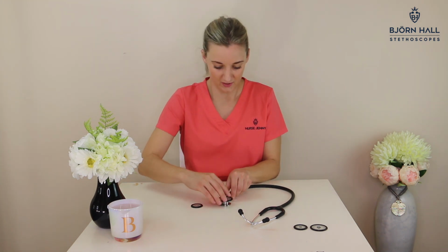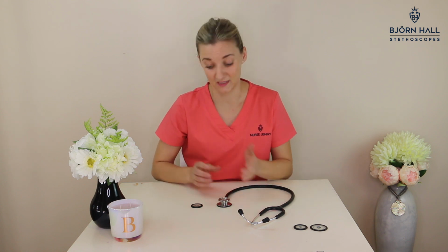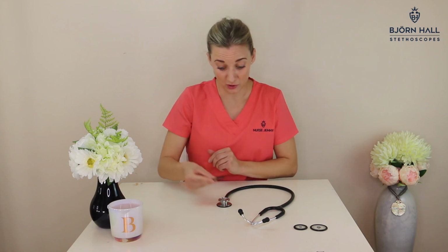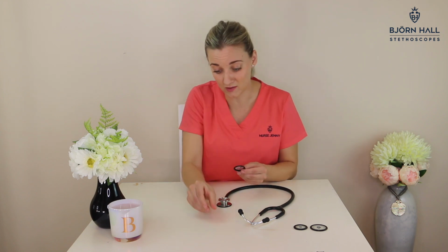Okay, so now we're going to go ahead and put the small diaphragm on. The small diaphragm is a little bit harder to get on than the large one because it is smaller and a little bit less flexible. But it is the same way as you would put on the large one. Now I have the sign facing the tubing, so that when you use the stethoscope, the sign is the right way around. But again, you can have it whichever way you want it.